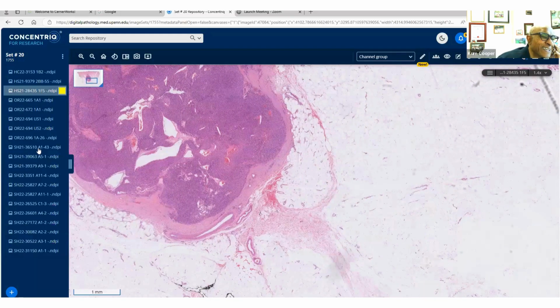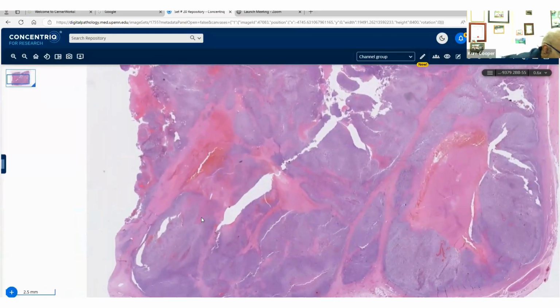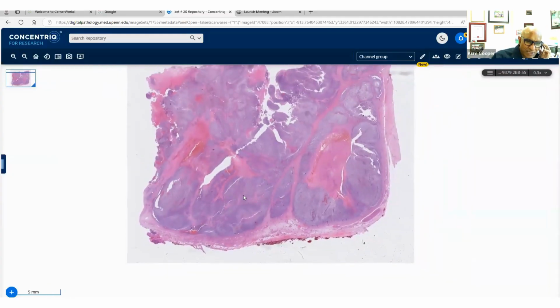All right, let's go to this case. It's another interesting case that I got a few years ago. These are mainly from 2021, 22. So they're already 3, 4, 5 years old. I'm starting with this one, which is a neck mass. The patient is 32. He's a young male, and the mass is about 10 centimeters.